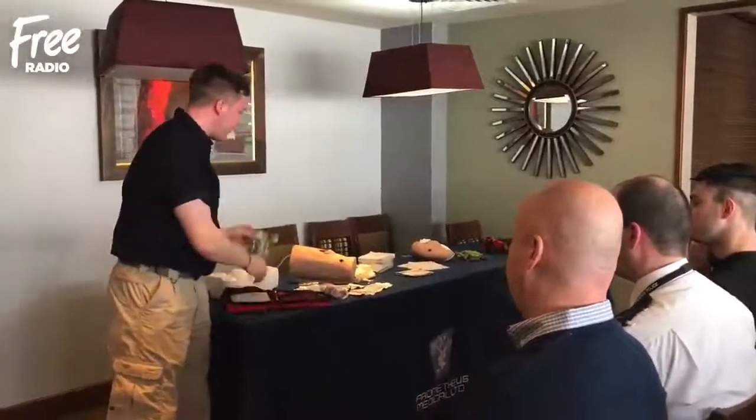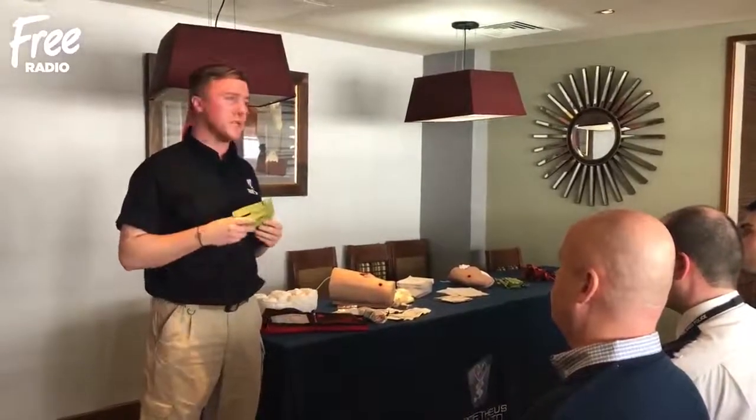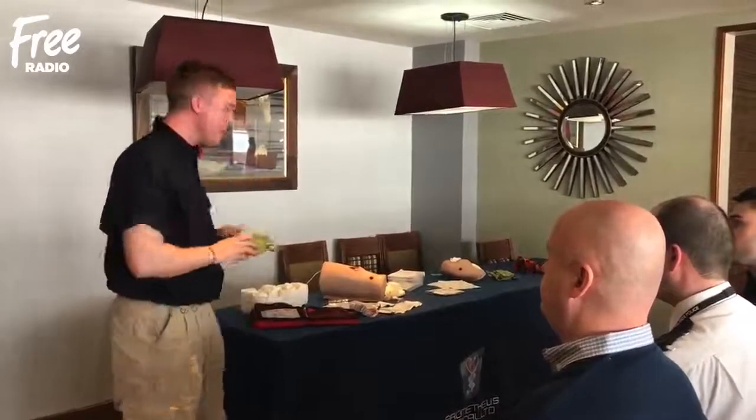We've got a pressure bandage — a really high compression bandage, which is very, very elasticated. It has a couple of great features on there as well, and this is for dressing the wound and getting that compression on there.